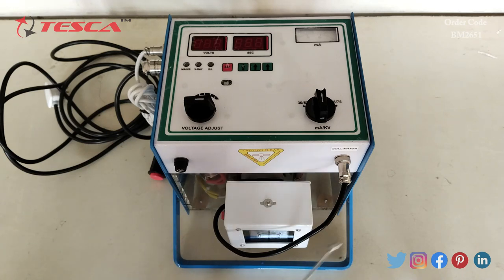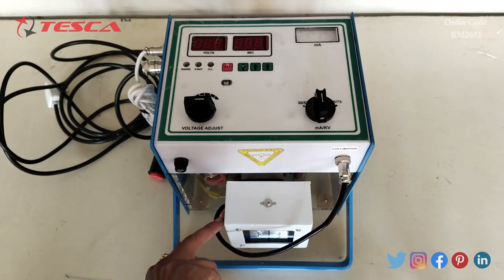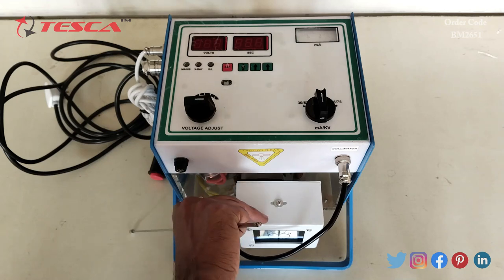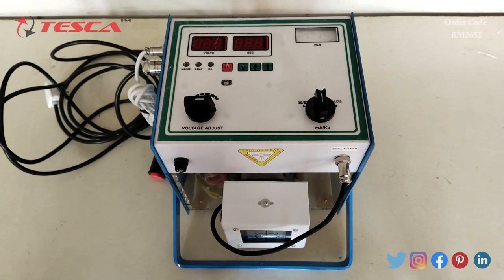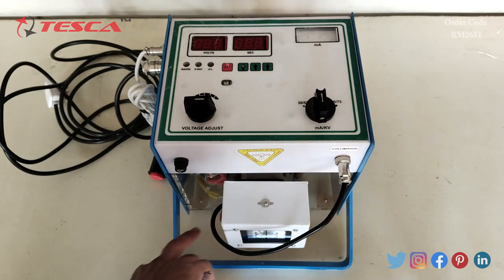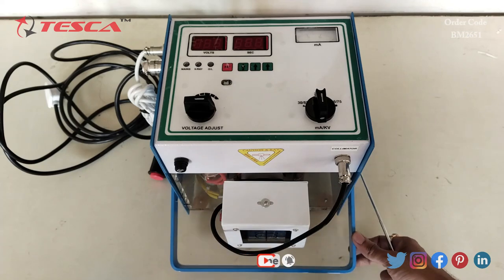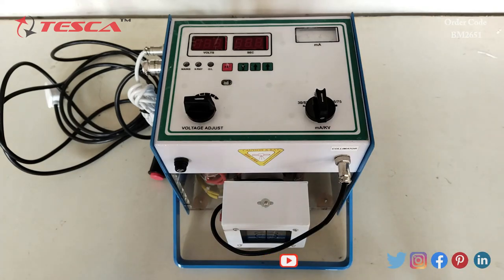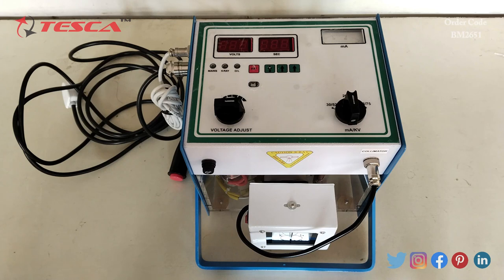The collimator light supply connector and the collimator light on/off switch are present on this side. The mirror centering adjustment knob is also present, and the focal spot position can also be adjusted using this. That covers all the components present on the kit. All connection procedures are explained in the manual.